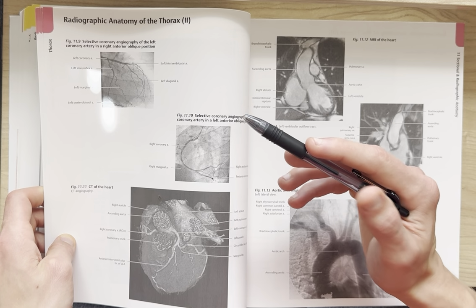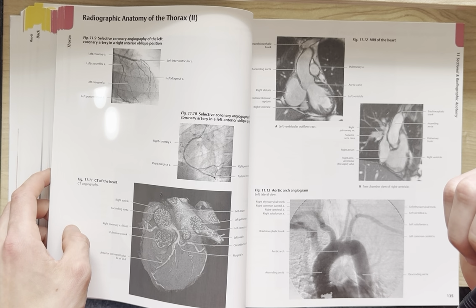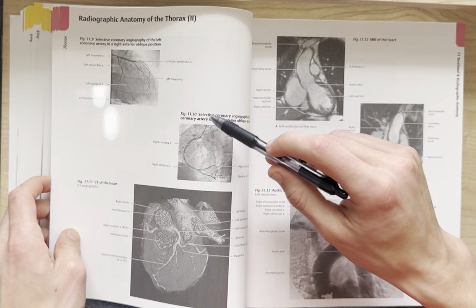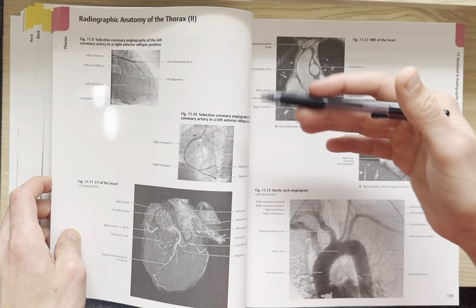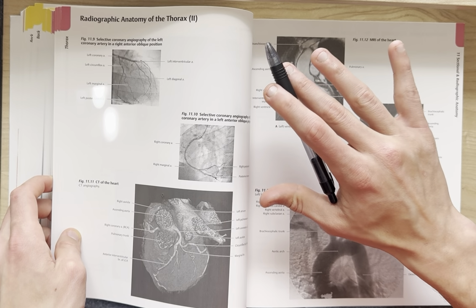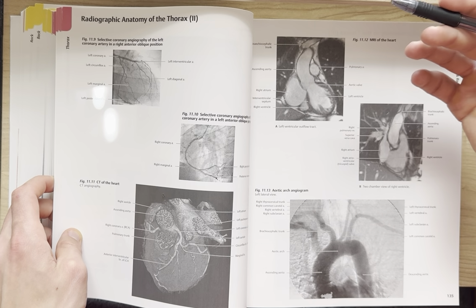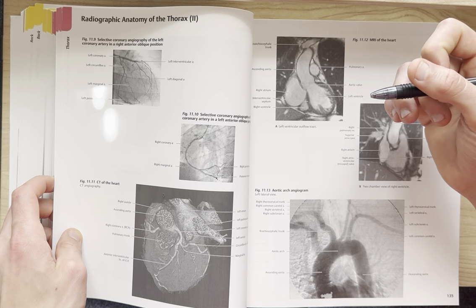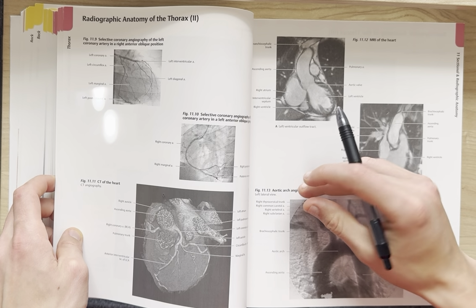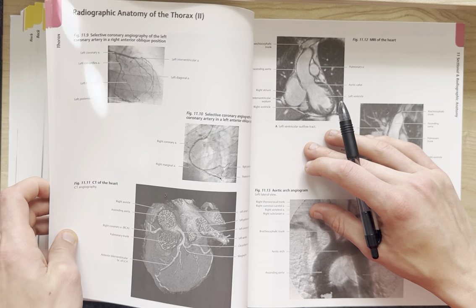Basically, what's taking place in these images is they are checking the blood flow going through some of the major arteries of the heart to rule out blockages or occlusions, to see if stents need to be installed, especially if the patient has had chest pain or has experienced a heart attack. They want to identify where the heart attack has taken place, because the clinical name for a heart attack is myocardial infarction, and infarction is blockage. So, that's what we're looking at here.